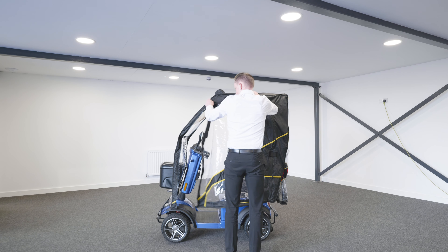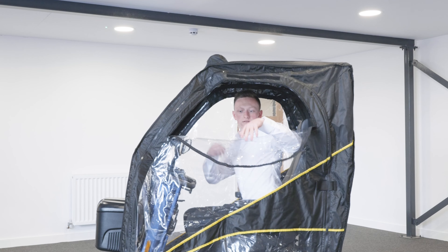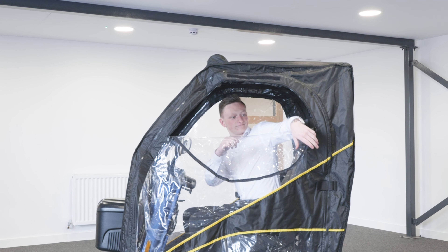To access the scooter, simply unzip one side from the bottom towards the top. The canopy has some fantastic convenience features. The easy access windows are specifically designed to help you when you're out and about.